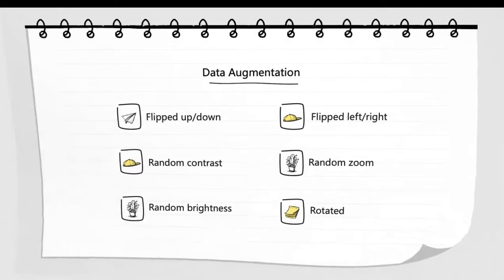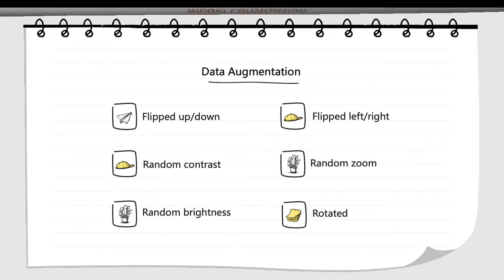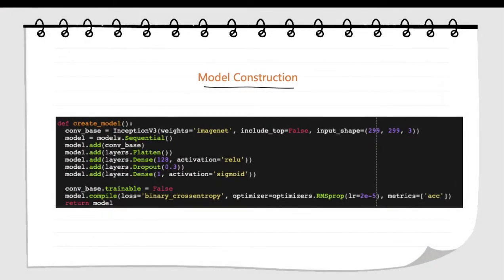Apart from this, to combat the rarity of tumor patches, we apply several data augmentations. We rotate the input patch by 4 multiples of 90 degrees, apply a left-right flip, and repeat the rotations. Then, we utilize the Inception architecture in Inception v3 and a single dense layer on top of that model. We use dropout to avoid overfitting and selected RMSprop as the optimizer.